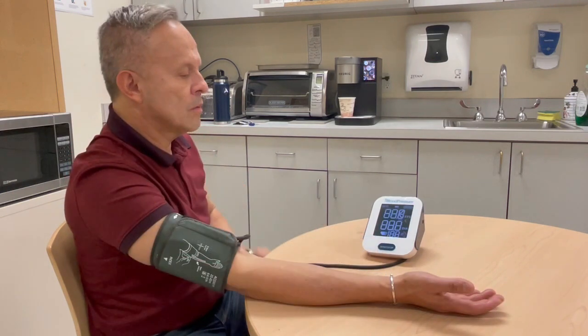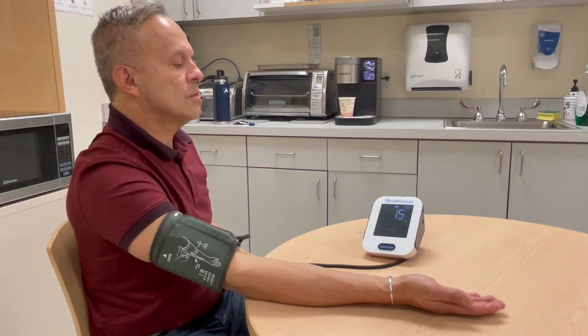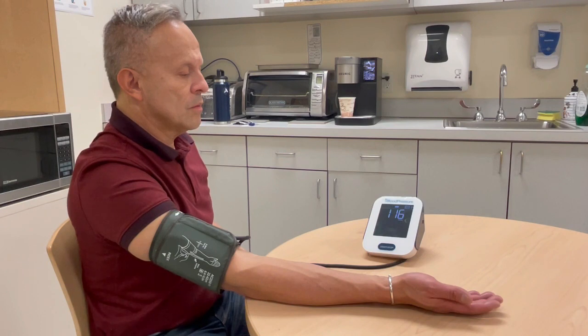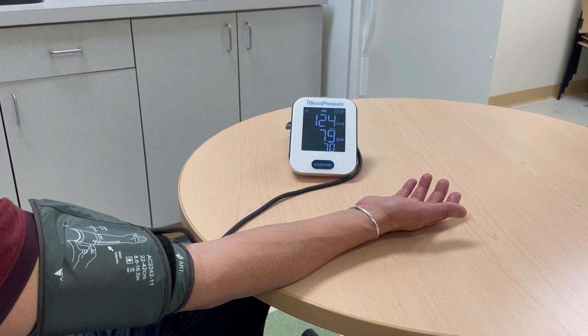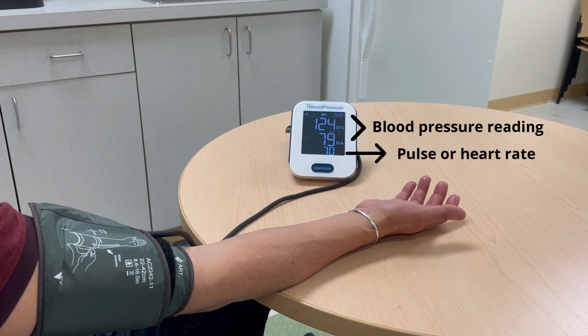Press the start stop button once to turn on the device and begin the reading. The cuff will inflate for several minutes and then deflate in order for the device to take the measurement. Your blood pressure reading and pulse will both be shown on the digital screen on the device. The blood pressure reading is the first two numbers and the pulse or heart rate is the third number.